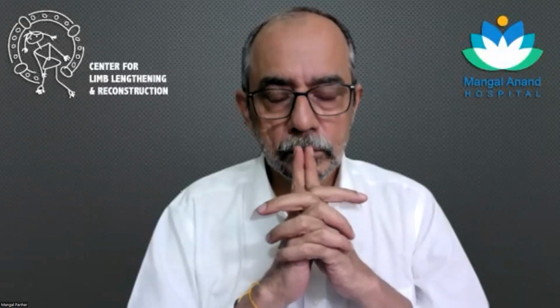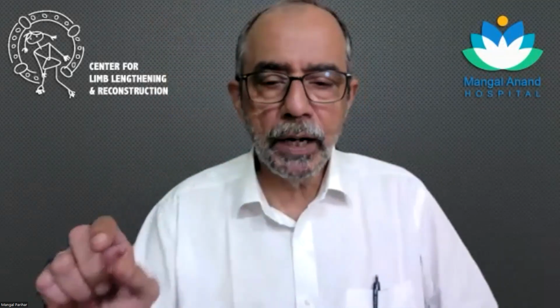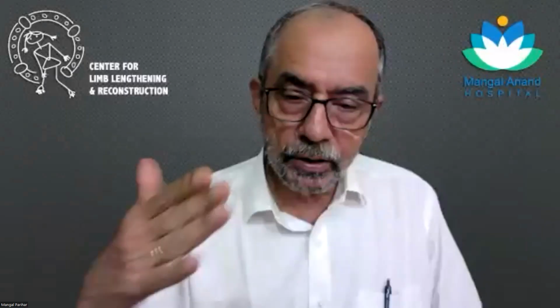Okay. Sir, in the biplanar osteotomy that has been described classically for Tomofix, the vertical limb goes up towards the knee joint. Yes. And they say if the requirement of the opening wedge is more, you can do it inferiorly also. Yes. Now, would it be okay if, as a routine, we do only an inferior cut, not the superior cut? No, the inferior cut has got a lot of problems. It's a very thin part, going into cortical area. There is a risk of breaking that because you're doing a large correction.